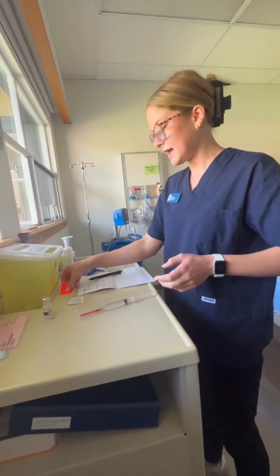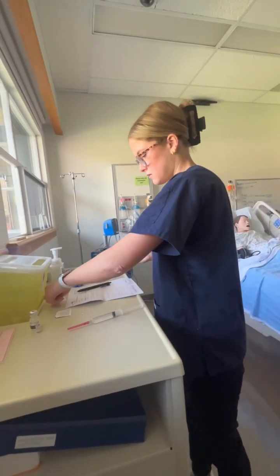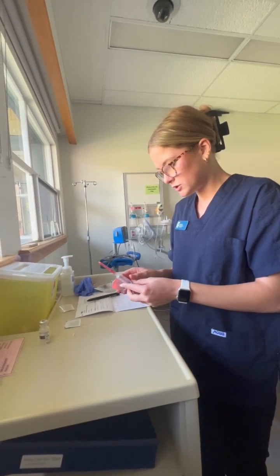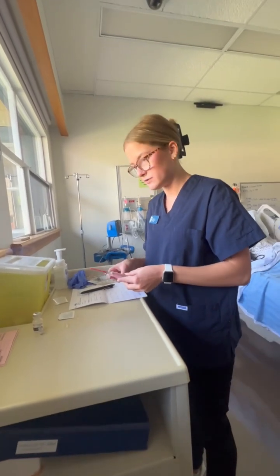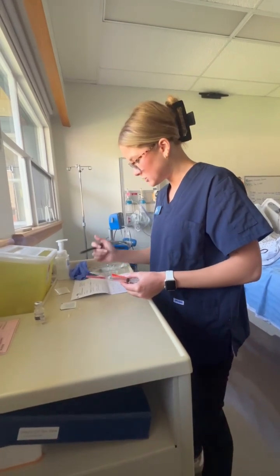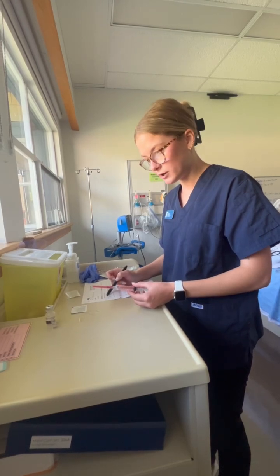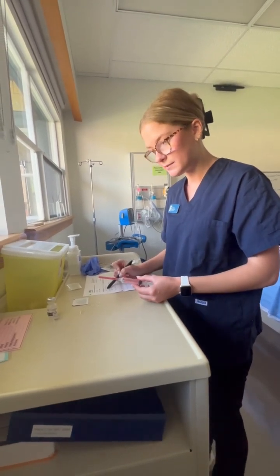All right, and I have the medication label here, so I'm going to put that on the medication. At this point, I'm also going to go through my rights to ensure that I have the right medication for the right patient. So, right patient, I have Elizabeth Bennett. Right drug, this is morphine for her pain. The right dosage, I do have the 2 milligrams here.